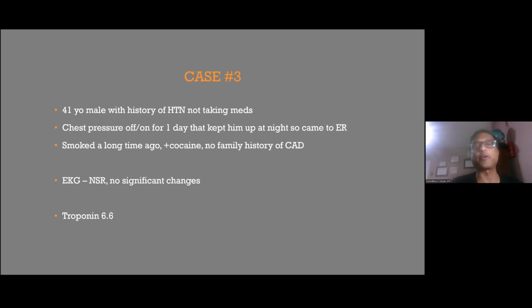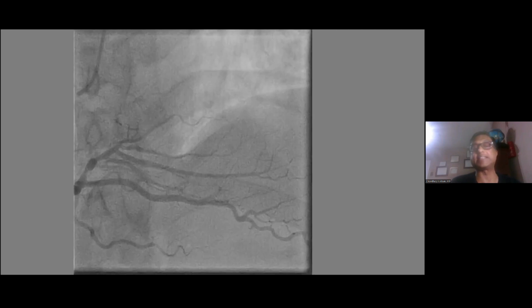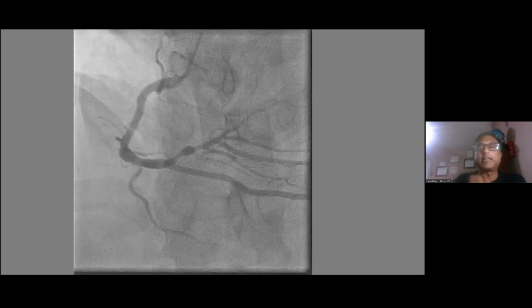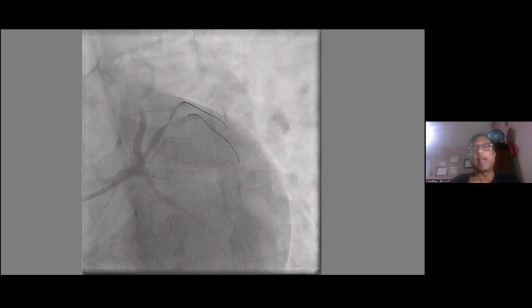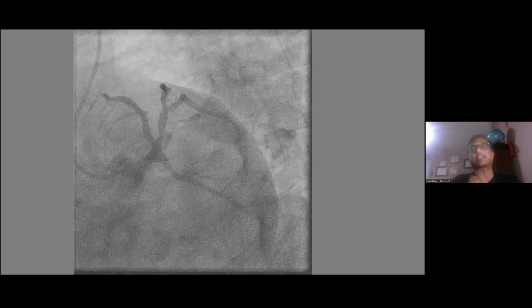So this is another patient, a 41-year-old with this RCA. Look at the significant changes in the remodeling, as Dr. Narula was mentioning about the Glagov remodeling, positive remodeling without any significant luminal stenosis. But in the left system, there is a significant bifurcating lesion. And we did the IFR on both, and then used the bifurcating stent technique, and then came out good with just the IFR assessment on both. And so far, the patient has been doing okay.